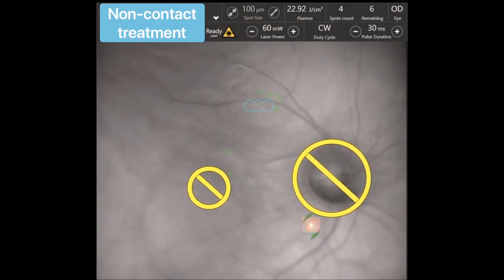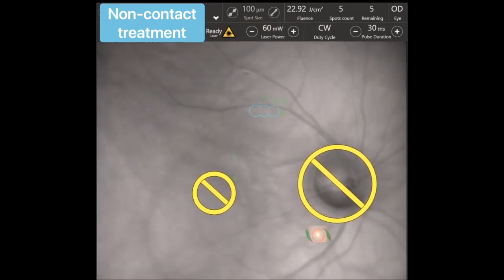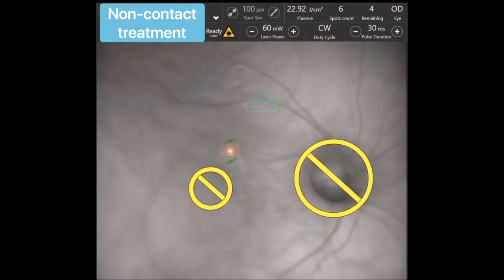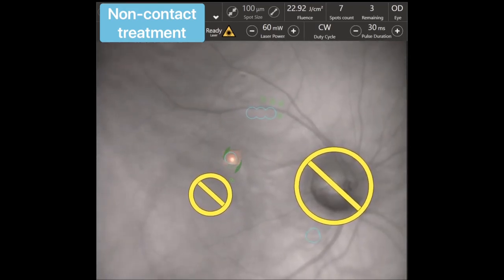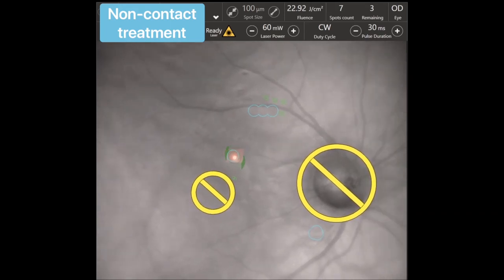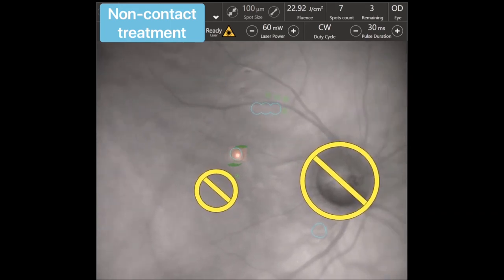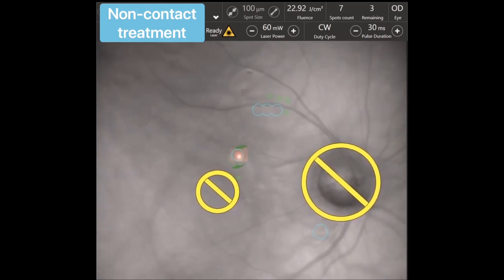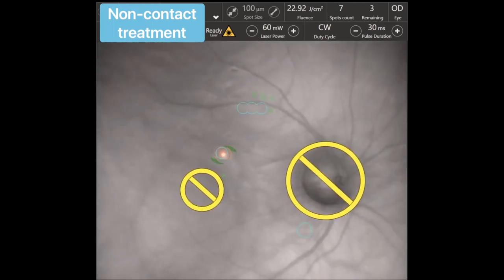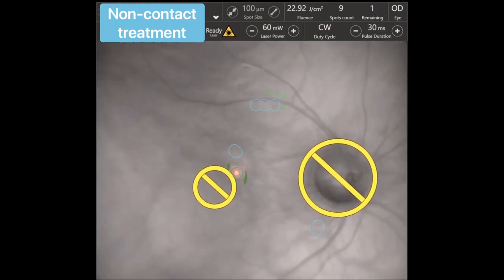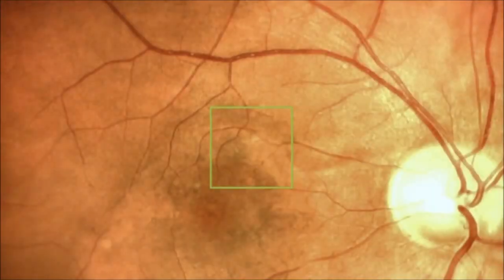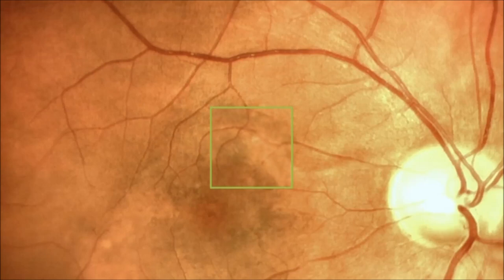In connection with the proximity to the macular center, we chose a coagulate of first degree, which corresponded to 60 mW. Selecting it from the screen, we then proceeded to non-contact navigated focal laser coagulation. We chose 30 ms exposure, as it is delicate for the macular region, short enough for non-contact treatment, and allows good control of burn intensity in comparison to shorter exposures.